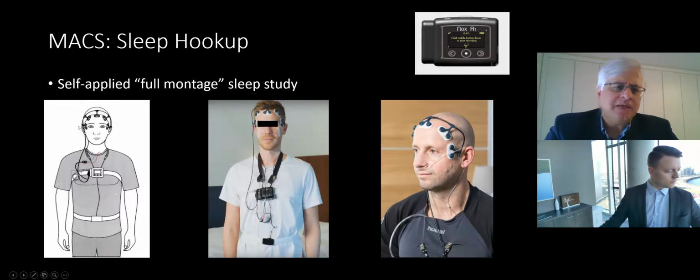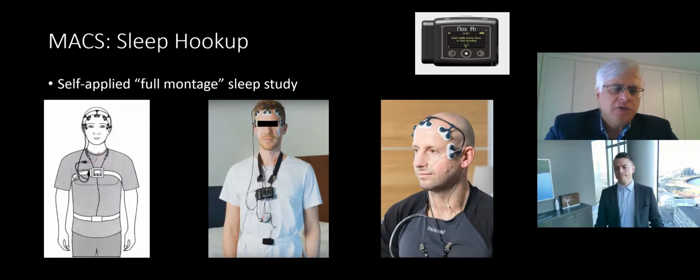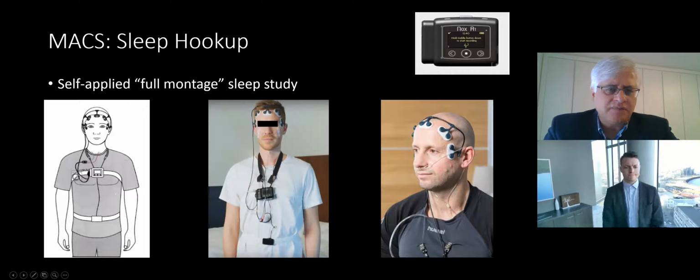They are placed in a circumferential manner. There are 5 touch points, 2 that are centered around the eyes, 1 at the vertex of the frontal center, and then 2 in the middle. And you can see a graphic of an individual on the left side, and you've got an actual individual that's configured with the Nox A1 and a close-up view of what this lead looks like.